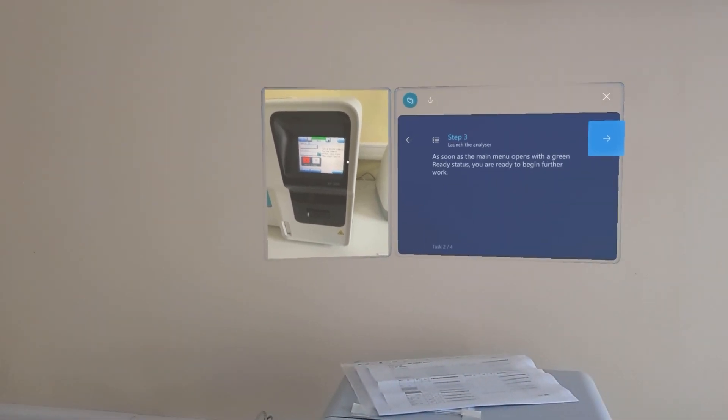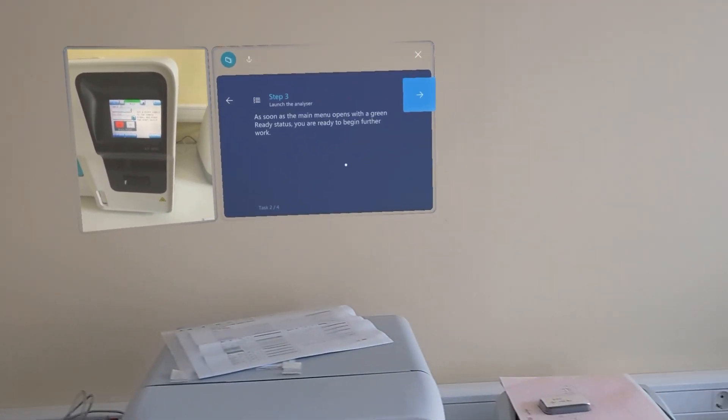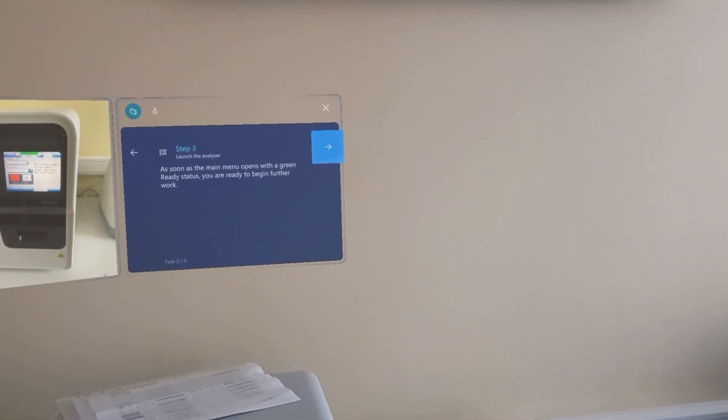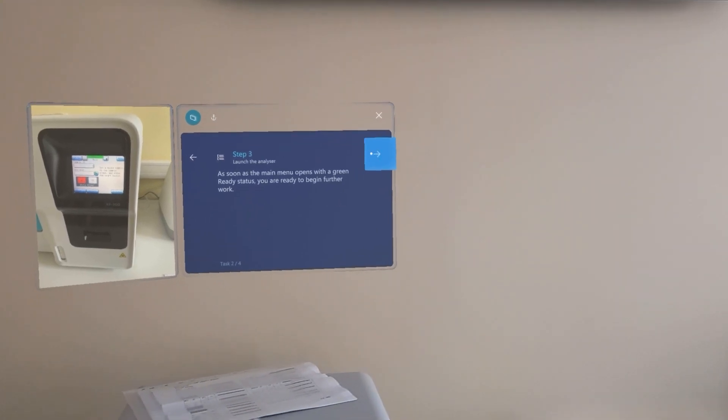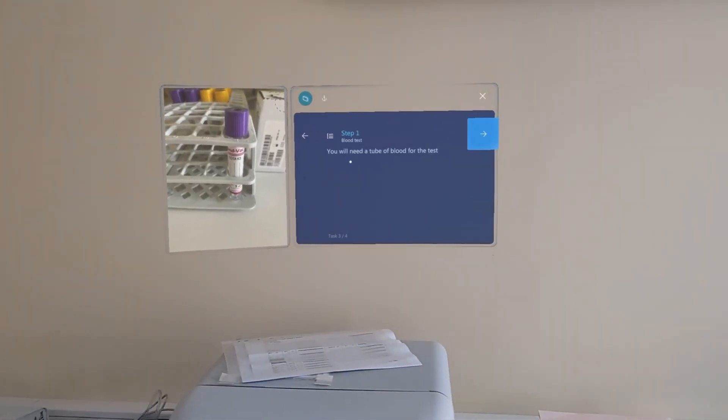After that, as soon as the main menu opens up with the green ready status, we can start our work.